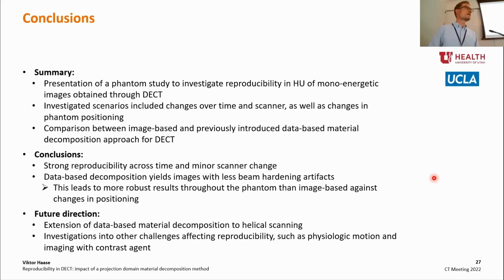One more question. So I saw you did 2 consecutive scans, 120 kV, 80 kV. And for the image-based method, the clinical dual source dual energy scanner, they actually use 140 kV, 80 kV on the Flash scanner with a tin filter, and 150 on the Force scanner, right? So I think the spectral separation has a big impact on this whole thing, right? And anecdotally, on the clinical scanner, when I look at the ACR phantom, you might notice some artifacts, but I didn't really see them as severe as what you show here. Can you comment on that?